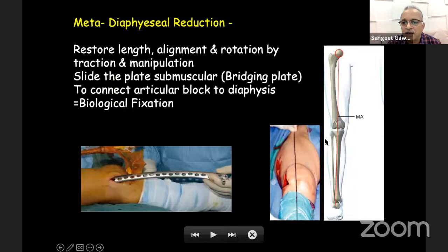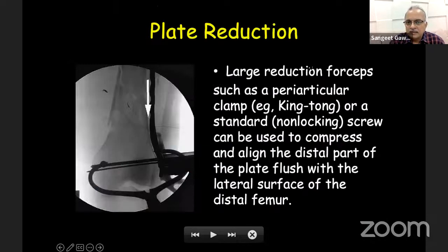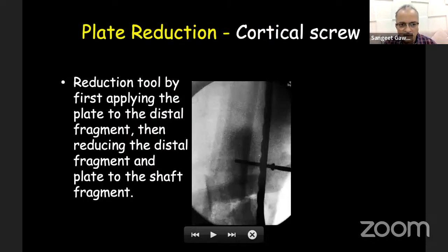Other ways of checking alignment are a cautery wire or a telescoping rod, which has to be matched to the center of the hip, the knee and the ankle joint, which is very difficult. And once you do that, then you connect the plate to the distal block and then to the shaft. Large reduction forceps, such as the king tong we use in pelvis fractures, are very useful for compressing the plate flush to the lateral surface. Otherwise, the plate remains proud, and that will produce irritation underneath the iliotibial band.